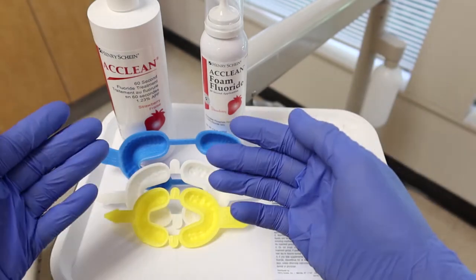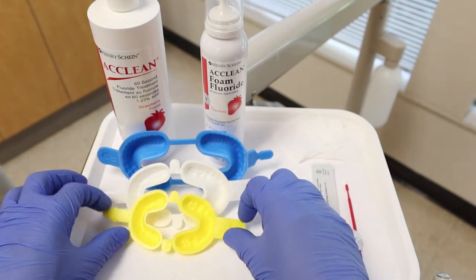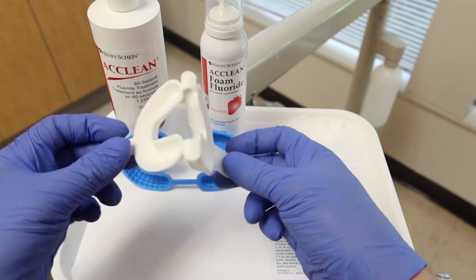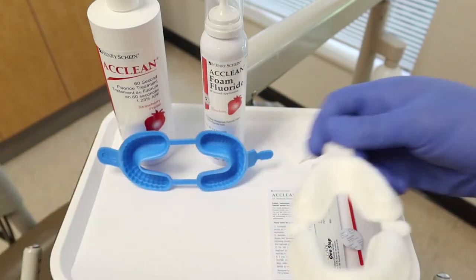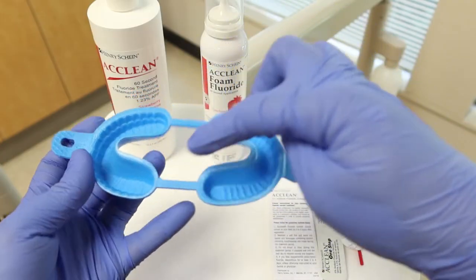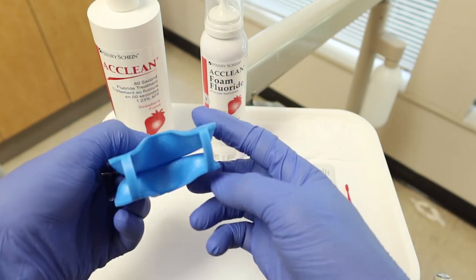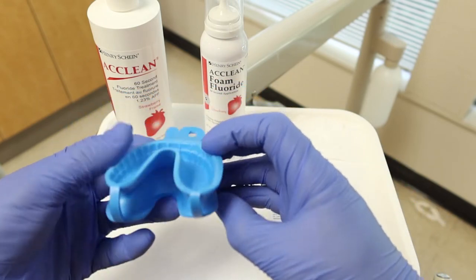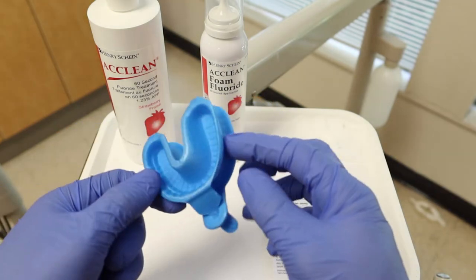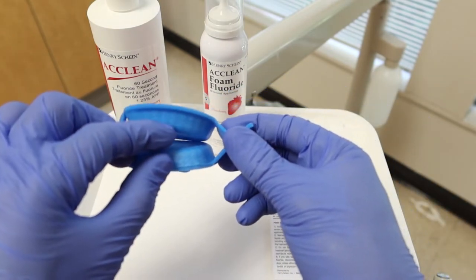Starting with our different trays, we have different sizes depending on your patient. We have those little kid sizes, and today we're not going to use that. Moving over to the more medium size — this doesn't seem like the one we're going to use either. But this blue size: once we go and fill our tray with our gels or foams, we can flip it inside out so it can be inserted into the patient's mouth. We can lock the bottom tray and the top tray together. There's going to be a little gap right here, which will be important when we come to it later on.